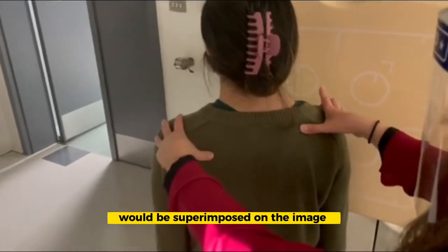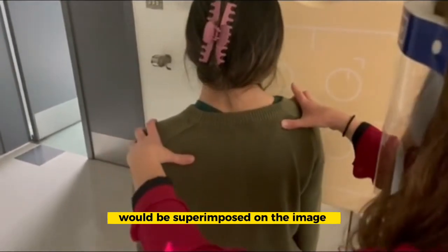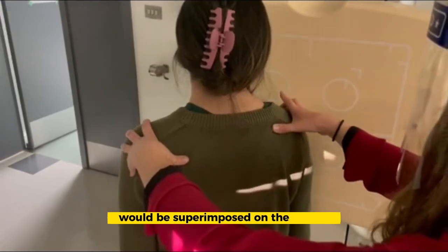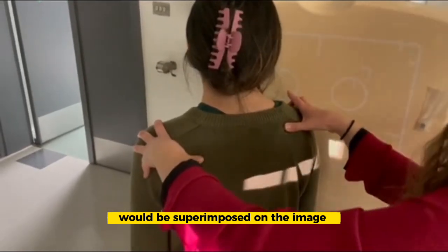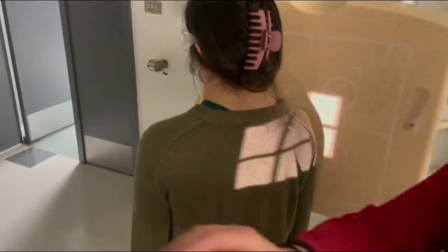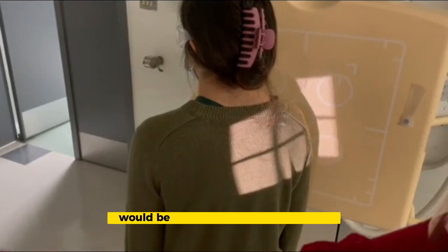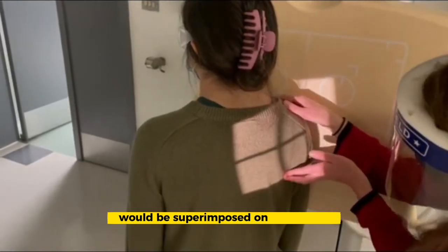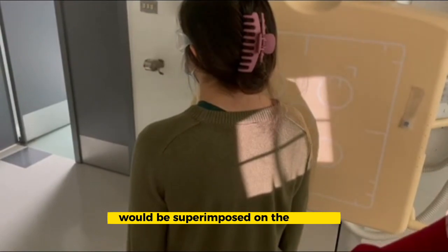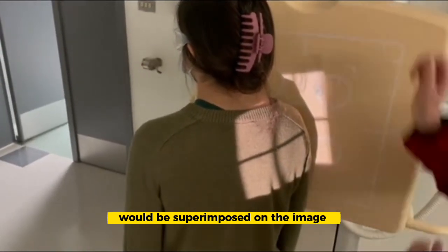The central ray for the PA oblique projection is perpendicular to the scapulohumeral joint, entering the medial border of the scapula and exiting the humeral head. Your middle vertical crosshair line should trace along that medial border of the scapula. Palpate to check and ensure that the inferior angle of the scapula is included in your collimated field.